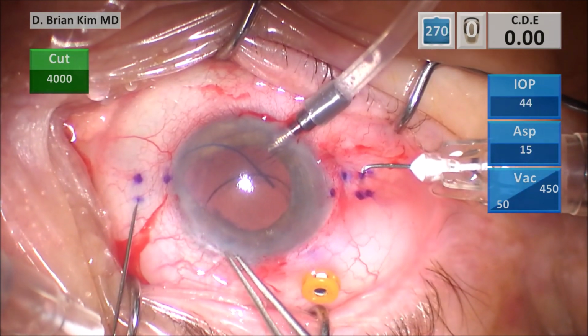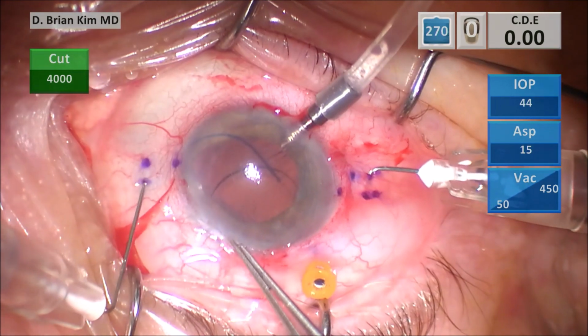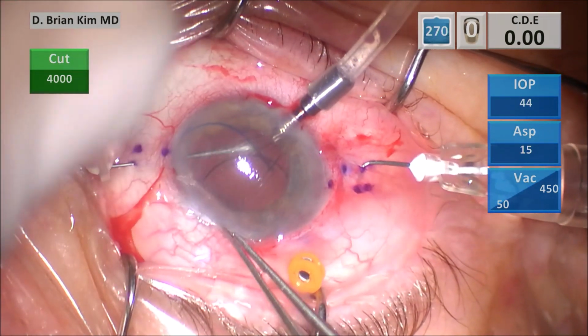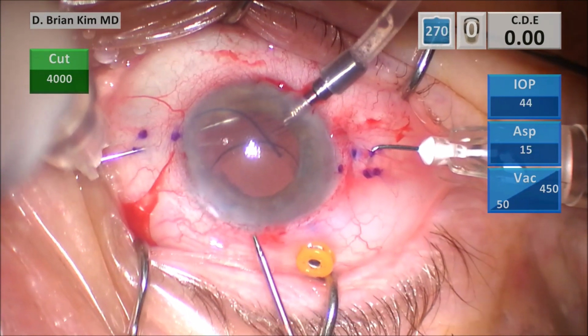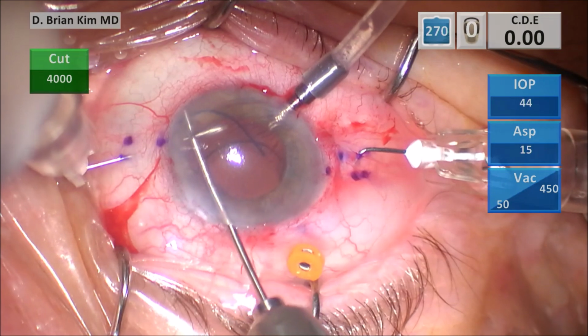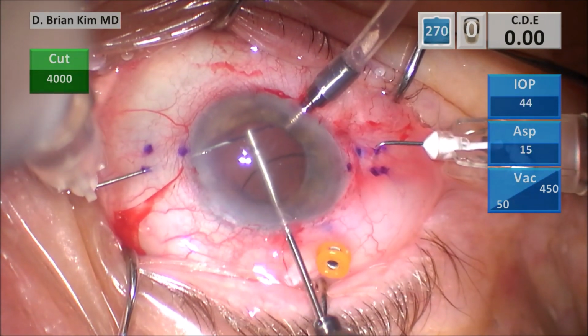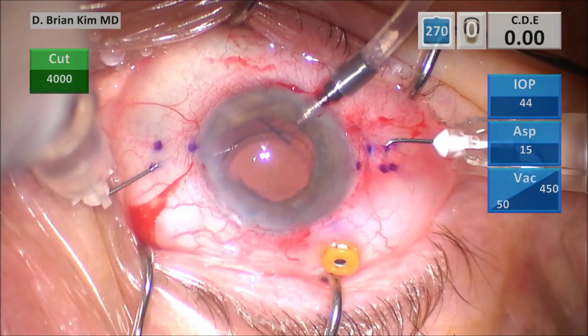I'm piercing the sclera through the first mark, tunneling 2 millimeters, and then diving down, making sure I am in the same plane before I rotate so that I don't hit the ciliary body. Switching to the microforceps, grabbing a little bit further than you think, because again, I'm going to grab, flatten out, dock it, and then advance the haptic into the needle.